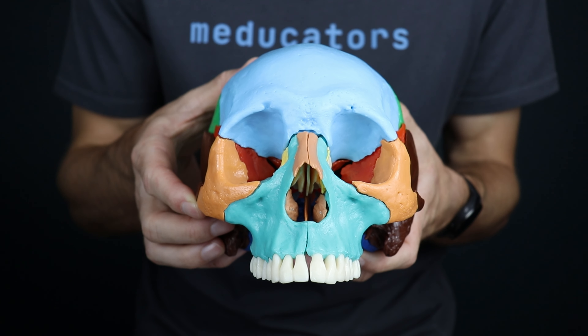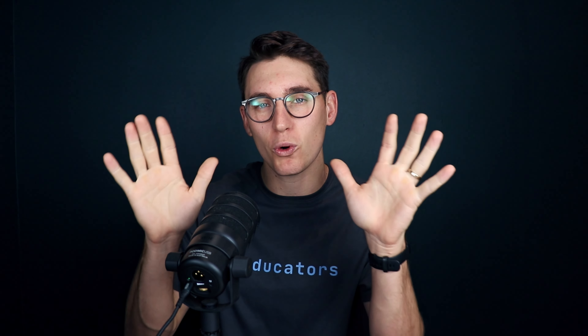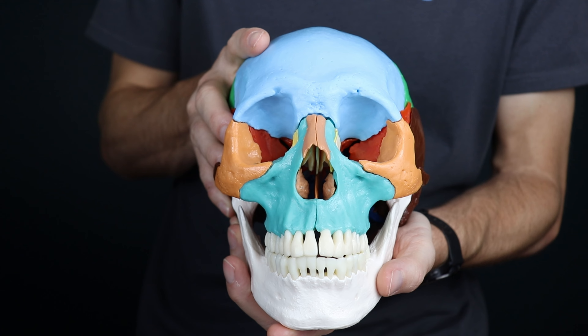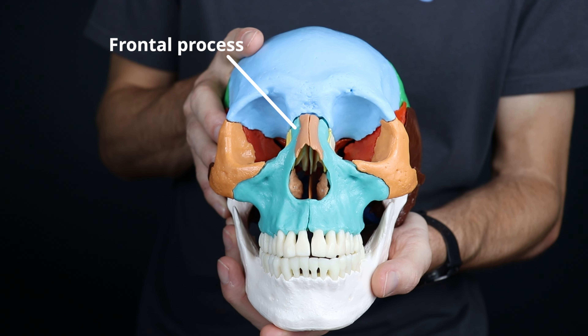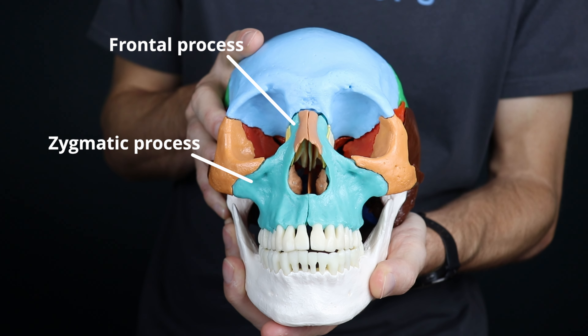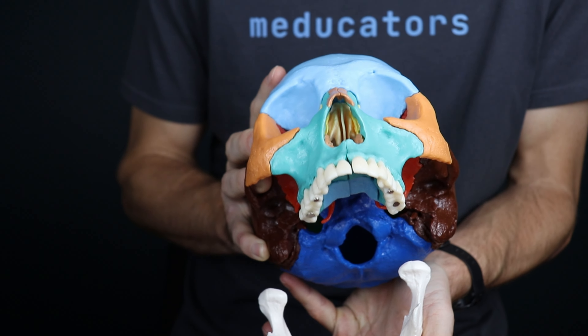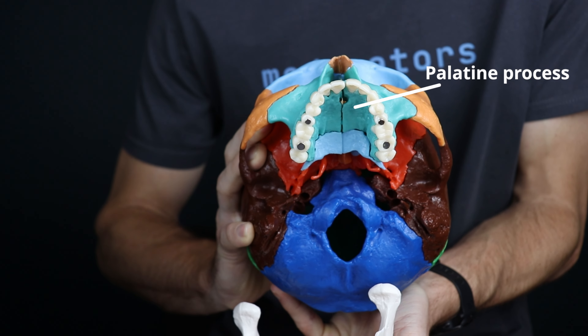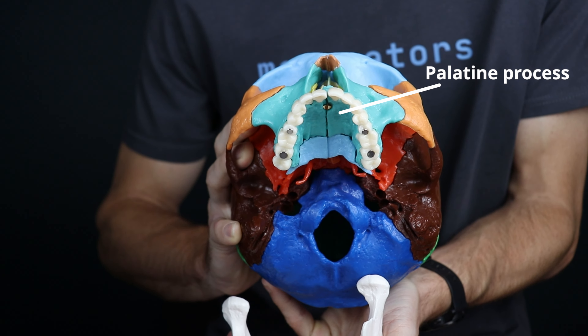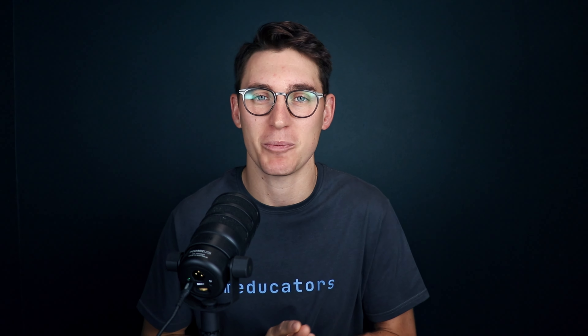The maxilla is actually two separate bones that meet at the midline at the intermaxillary suture. We can think of the maxilla as having a body and four separate processes: superiorly the frontal processes, laterally zygomatic processes, inferiorly the alveolar process, and the palatine process that extends posteriorly, which makes up the majority of the hard palate. Let's look at our CT scan to find the body and those processes.